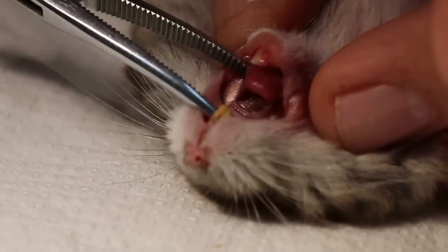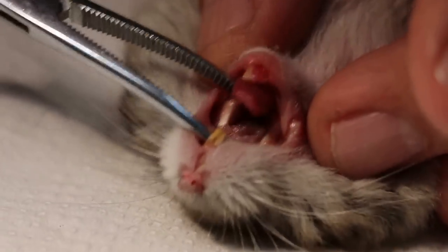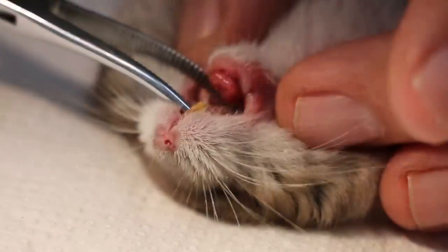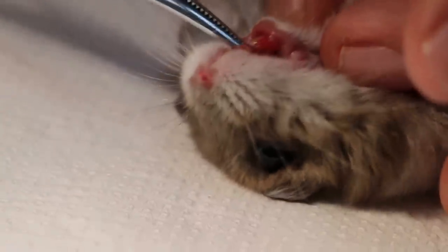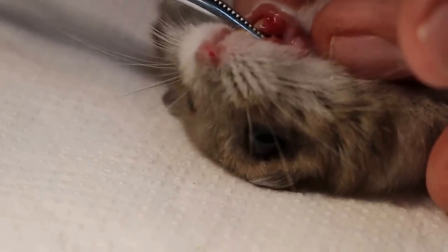So we check again. The hard palate is okay now. You can see nothing inside. Now there's a pass here. This one is okay, this lower one is okay.